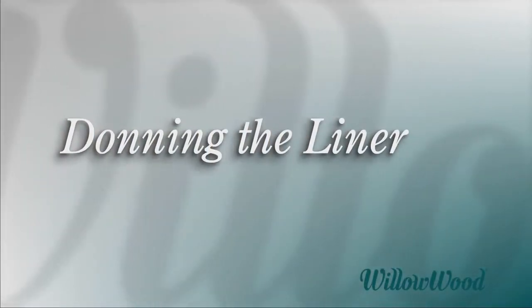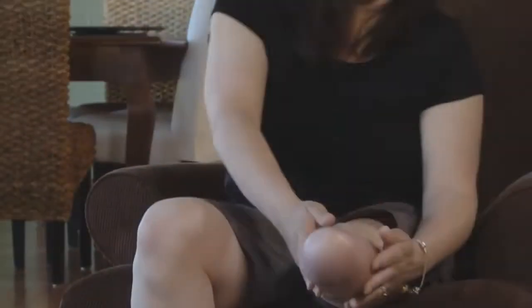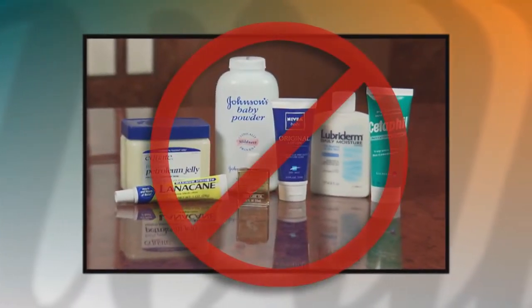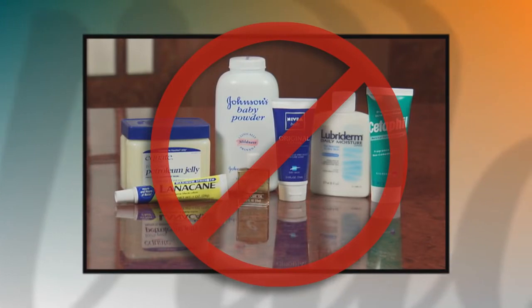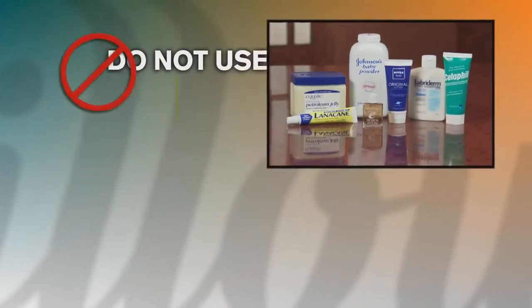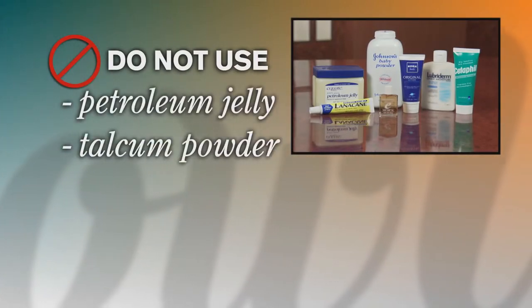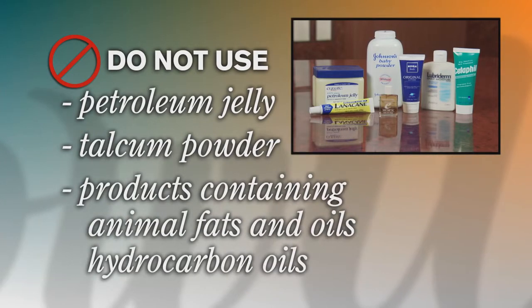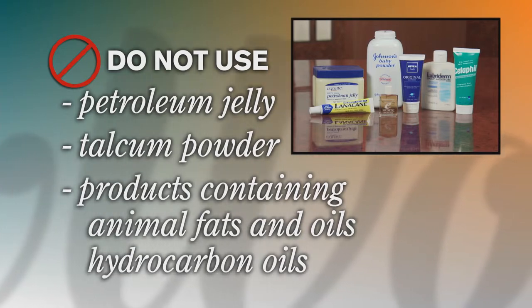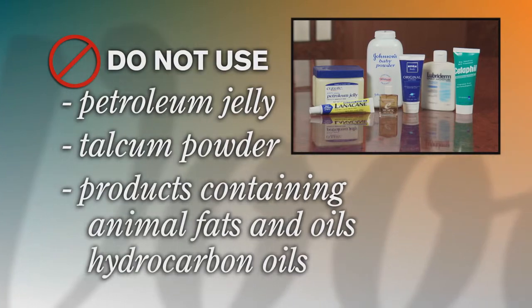Before donning your liner, make sure that your residual limb is clean, dry, and free of soap residue. Do not apply any type of lotion or powder, as it will react negatively with the alpha gel and possibly with the residual limb. Specifically, do not use petroleum jelly, talcum powder, or any other products containing animal fats and oils or hydrocarbon oils, even though these types of products may be recommended by other liner manufacturers.